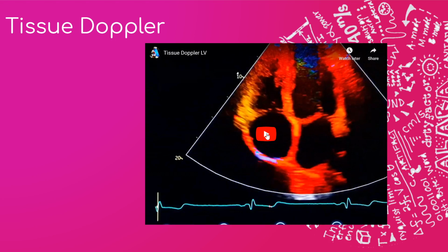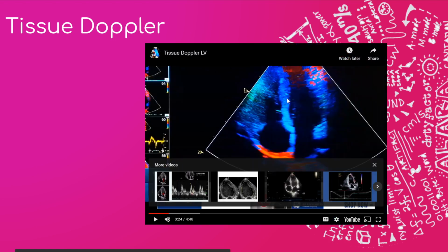So you can see the heart. Left ventricular tissue Doppler measurement. And you can see there's blood flowing through here, but the low pass filter is on. One of the most important evaluation for diastolic dysfunction of the left ventricle is tissue Doppler. We're not seeing blood flow. We're just seeing the low velocity. In tissue Doppler, first we get apical four-chamber, and then we select tissue Doppler. So we're just seeing the low velocities that are being generated by the contraction of the muscle.